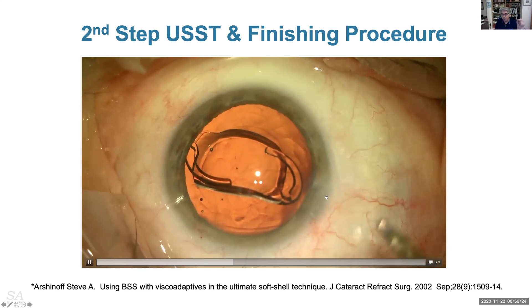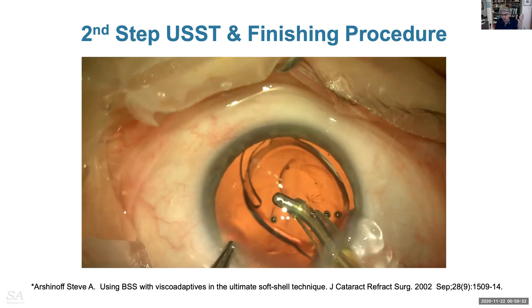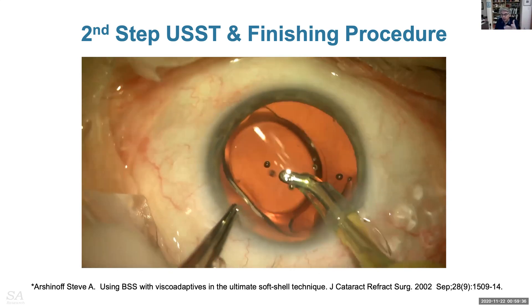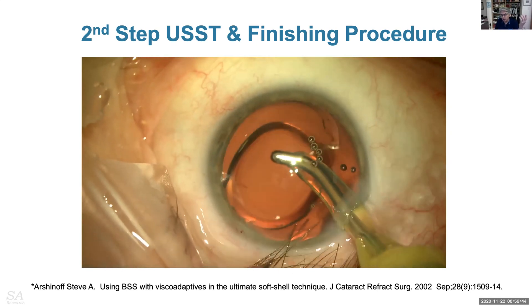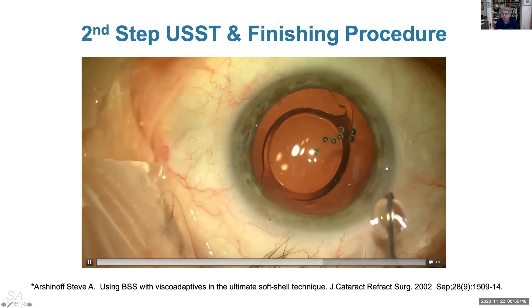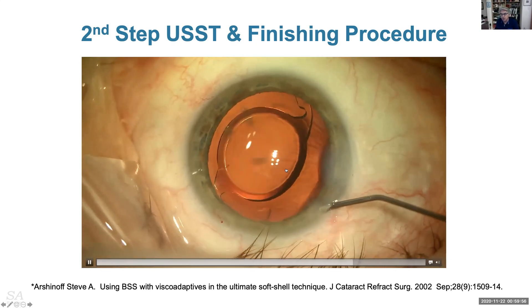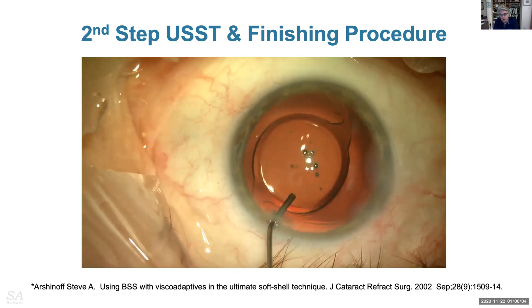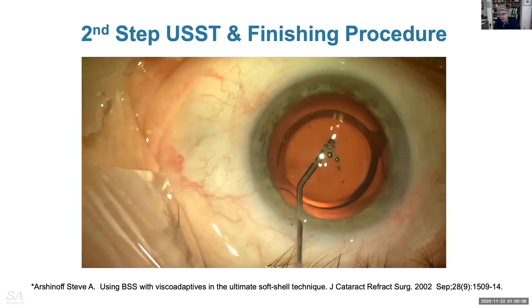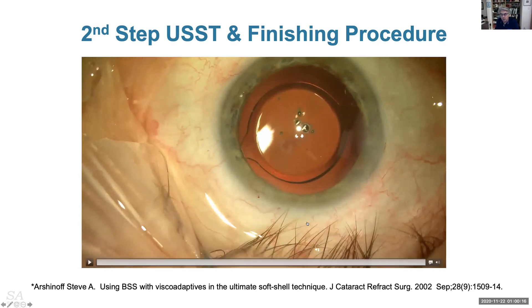You inject the lens just under the capsulotomy, not aiming at the posterior capsule — the capsulotomy is lubricated by OVD but the posterior capsule is covered with water. As you put the I/A in the eye, use it to nudge the lens into the bag; the lens opens and fills the bag, and by the time it opens the OVD is all out. The lens twirls and you stop it at your preferred axis, then seal the incision by hydrating it. Finally inject dilute moxifloxacin (0.4cc) to open the bag and make any final lens rotation. This reduces the number of steps and makes surgery safer.